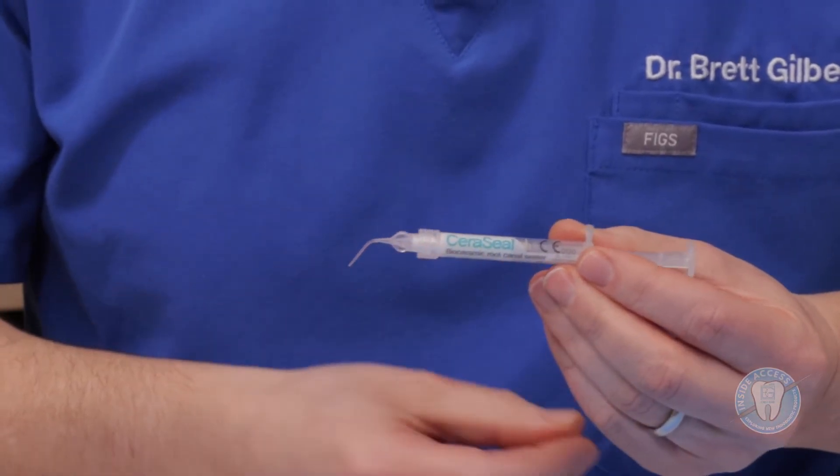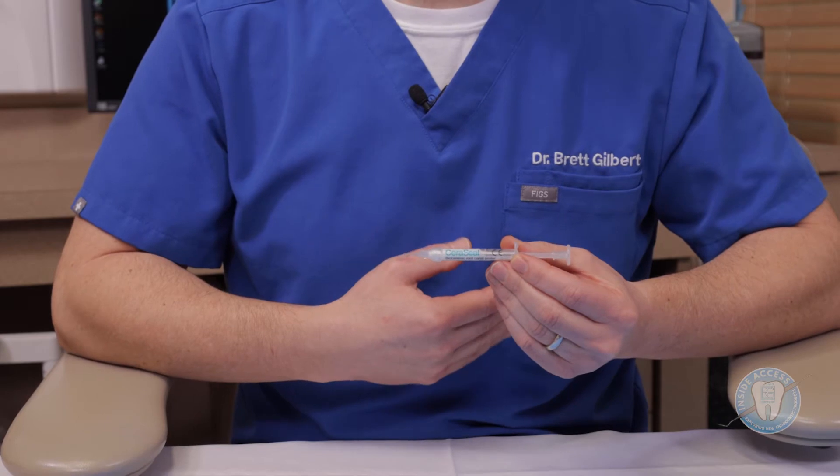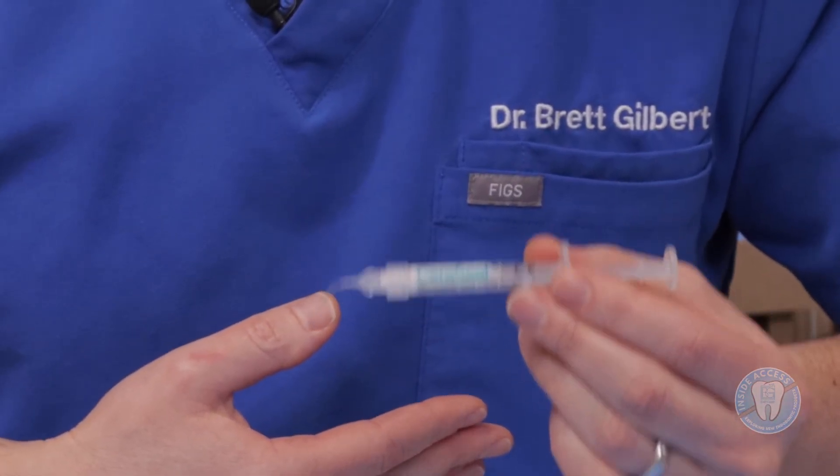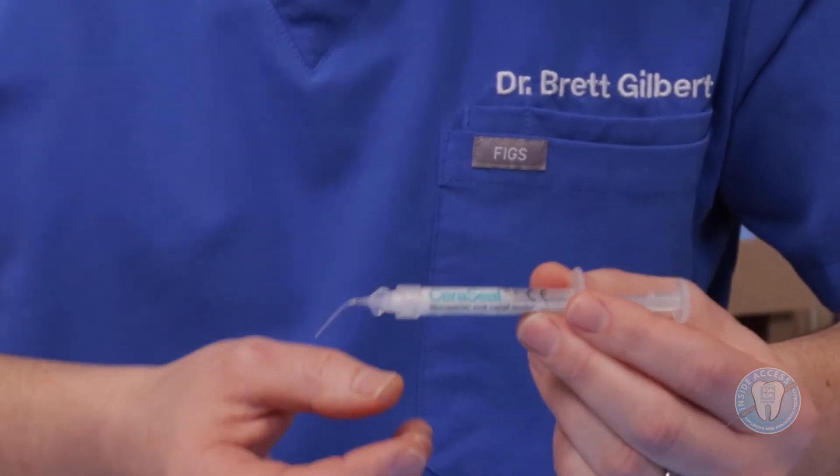The other Meta product I wanted to introduce is called Ceraseal. This is a calcium silicate-based bioceramic sealer. It also has a very fast setting time at three and a half hours, and it sets in the presence of moisture as most bioceramics do. The company's data shows a zero percent shrinkage rate, so you can place it in and get a seal very quickly with the three and a half hour setting and no shrinkage. This is the Ceraseal from MetaBioMed.